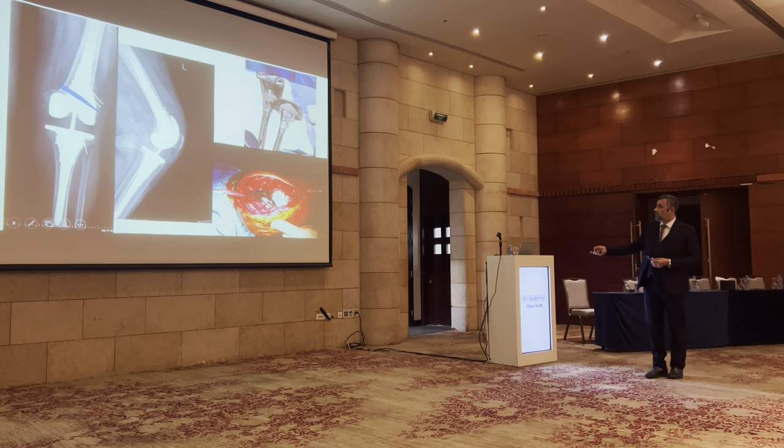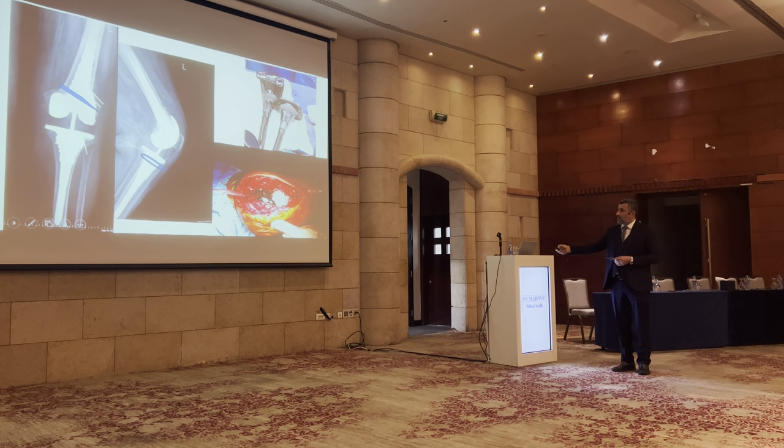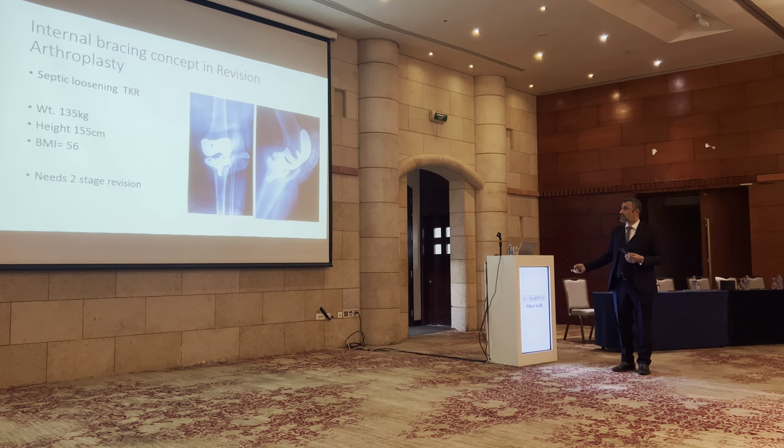Now, another case, look here. This is very good. So we have fiber tape like here, and we have suture material like here, extending to the material. That is okay. This is another complex septic loosening, a septic revision procedure.